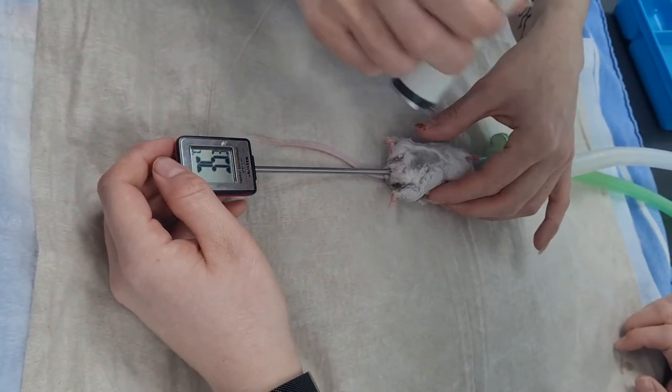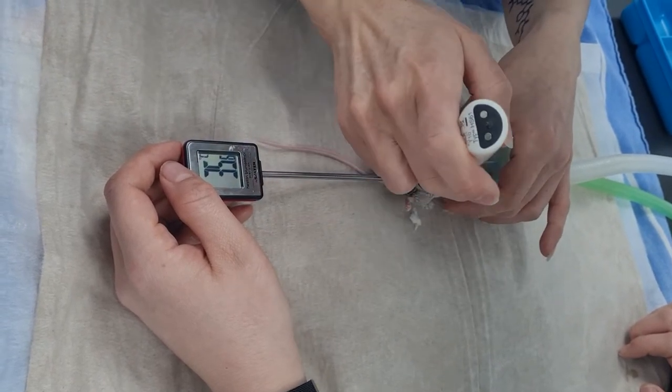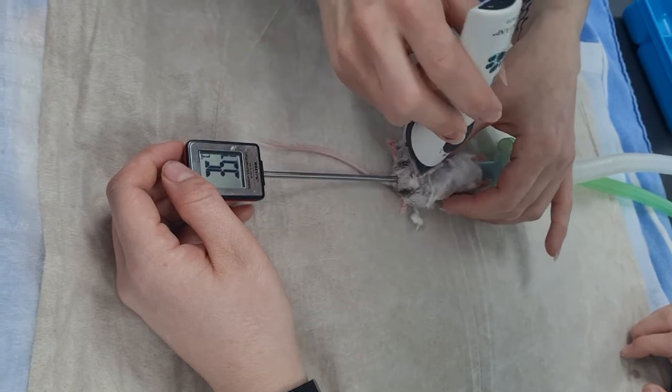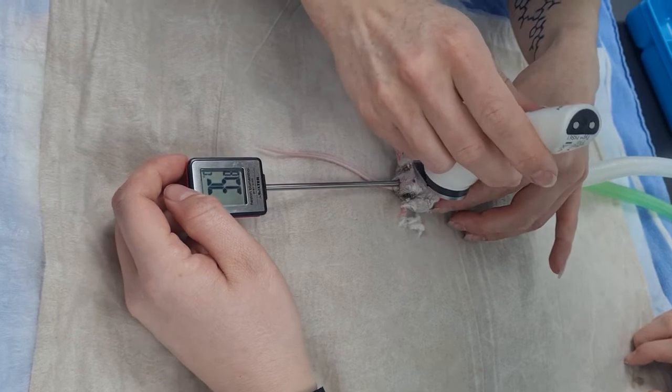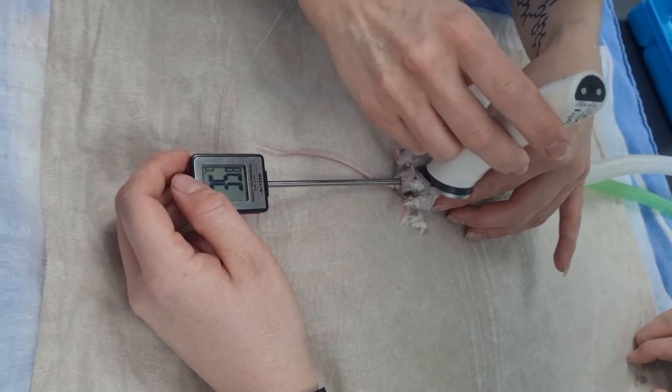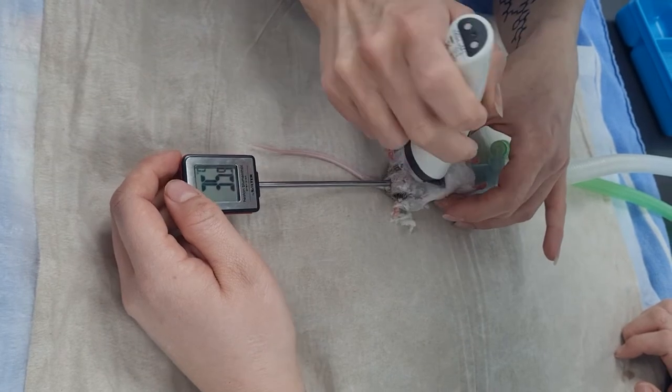Basically everything they're having injection-wise, until they get the atipamezole at the end, and obviously the fluids — everything they're getting is pain relief. Which I think is a major thing with rodents, well with anything, but especially rodents for preventing self-mutilation and trauma to the wounds.